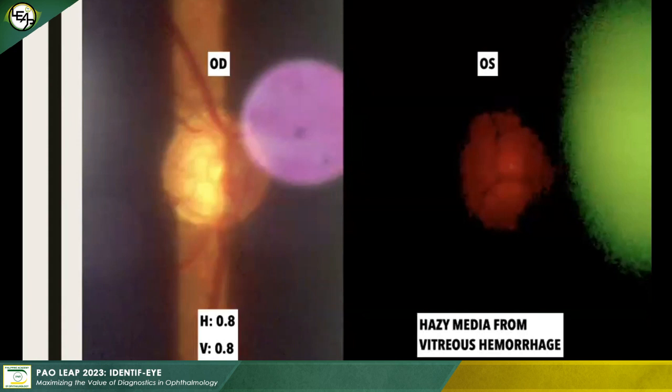So you examine the nerve. The right eye has severe cupping. The left has poor view from vitreous hemorrhage. And you perform gonioscopy on the right eye.